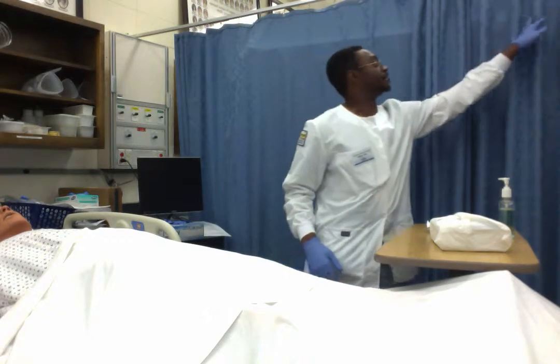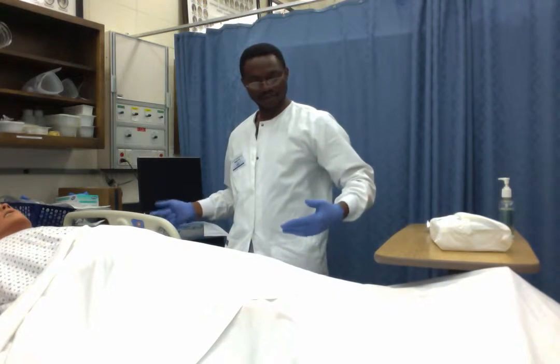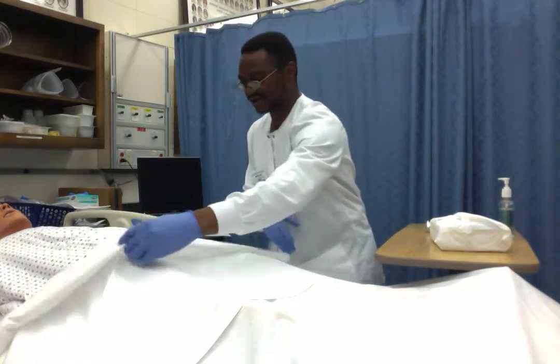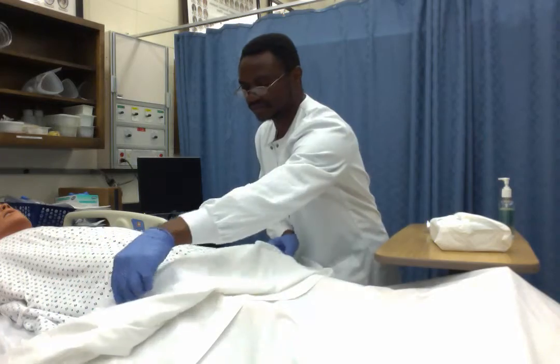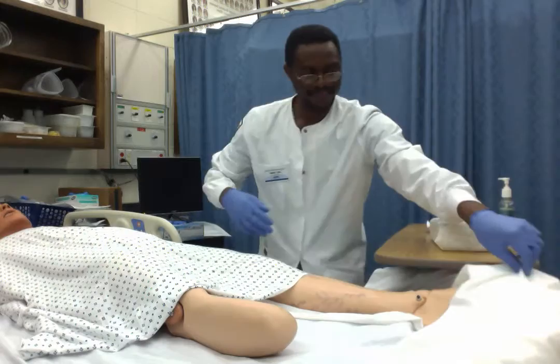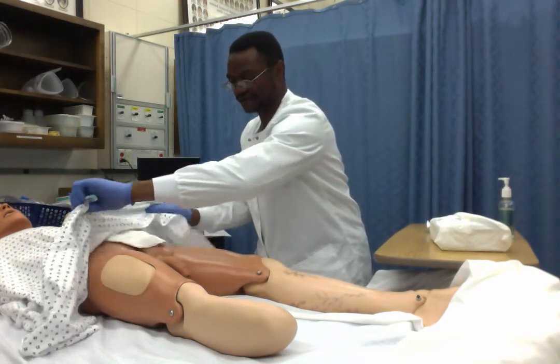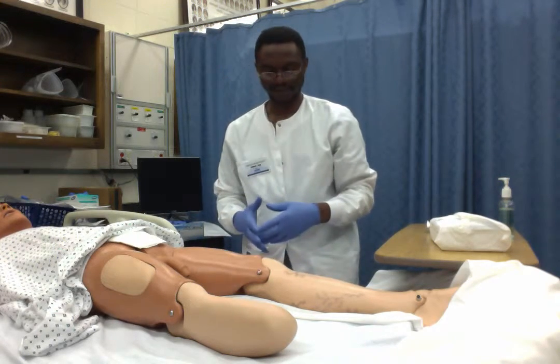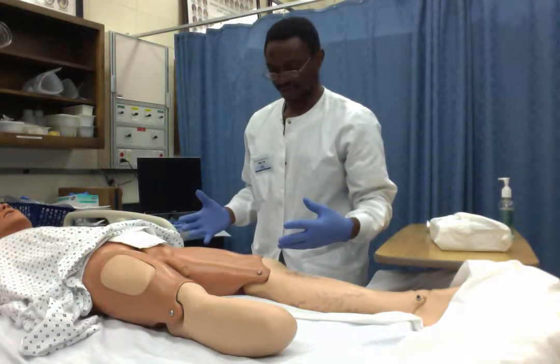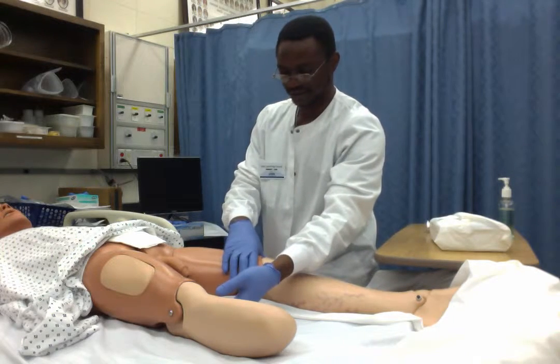I will provide for privacy and raise up the patient to a comfortable working position. Then I will expose the perineal area of the patient. I will do this while trying as much as possible to provide for his privacy. While my patient is still lying in dorsal recumbent position, I would ask him to put his legs apart.